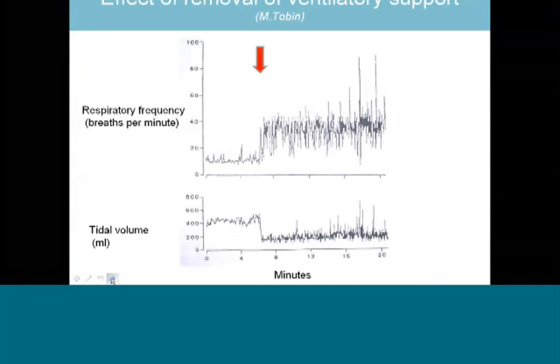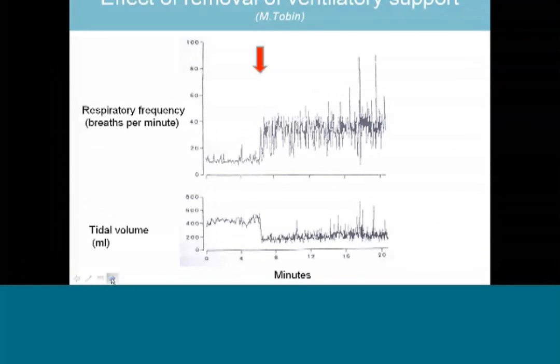A key thing that we also find is that if someone is fatiguing and they're breathing very, very fast, we can provide ventilatory support. And in the last discussion that was mentioned, because it can offload the work of breathing, and we can use the ventilator to assist with giving a deeper breath in. Conversely, if you're on non-invasive ventilation, we don't want to take you off to do airway clearance techniques. And the reason for that is shown quite nicely in this slide.